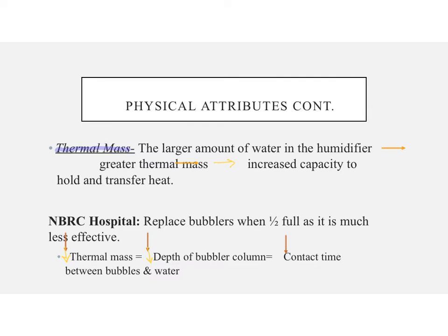So there's less water in the bubbler itself. So it's naturally decreasing that column of water, which is decreasing the contact time between the bubbles and the water.